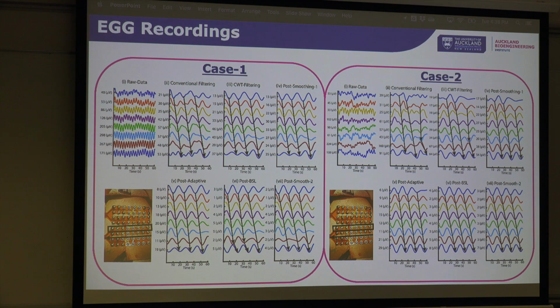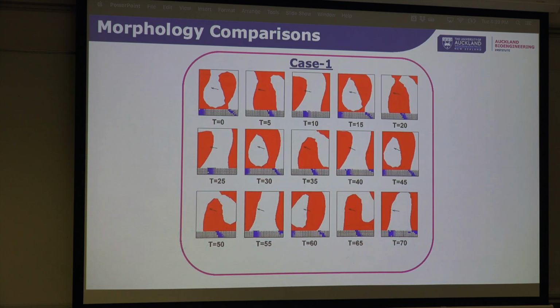And so what we can actually see there is if we're looking at a single row indicated by the black box in that direction, we can see that there was stable activity moving from the right to the left on both case 1 and case 2. So we can plot that with time for the serosal activity and the EGG recordings simultaneously.